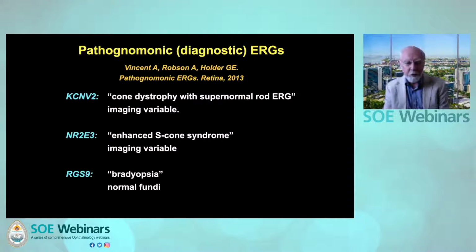Now, those two disorders were chosen because they are two of the three disorders in which the ERGs are pathognomonic or diagnostic. You need no information other than the ERG. That's rare, and these are the only three disorders of which I am aware.